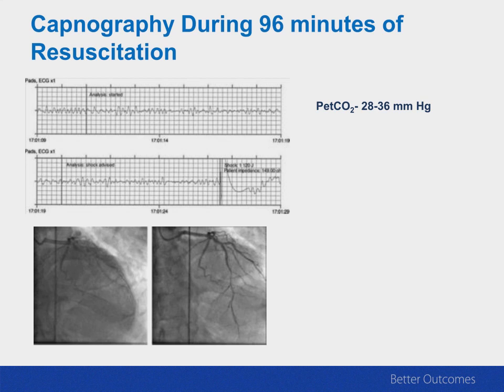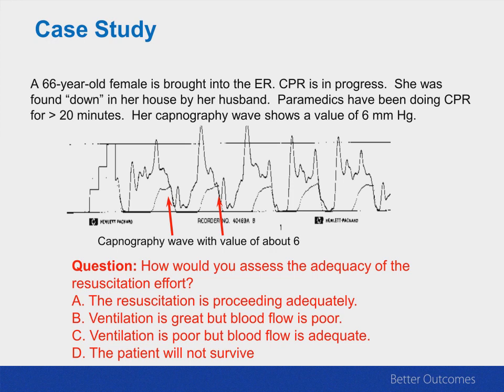It was running 28 or higher during the resuscitation, showing that the first responders were doing a wonderful job. Now, this is unusual; in all my years, I've never seen anything like this. But it points out that if you watch the capnogram during your resuscitation, you understand what's occurring in terms of helping identify who's going to live or not.